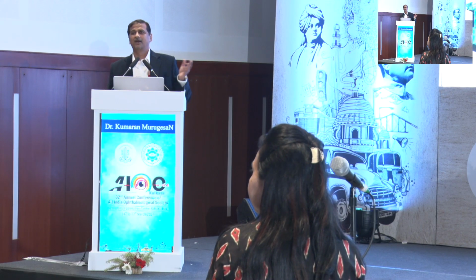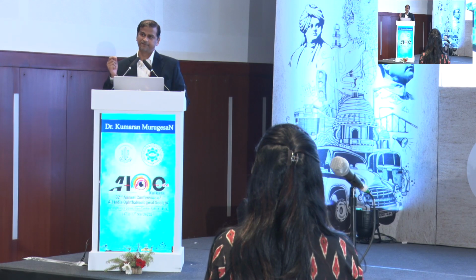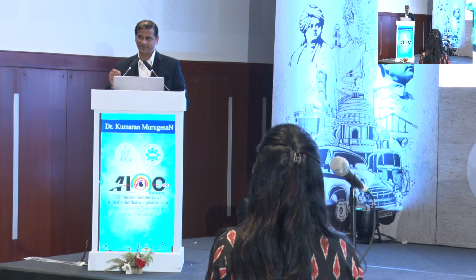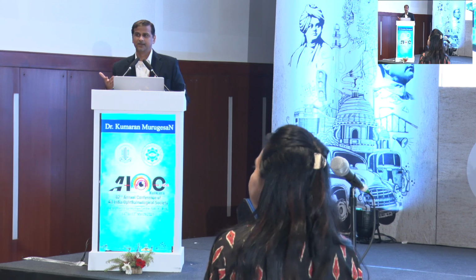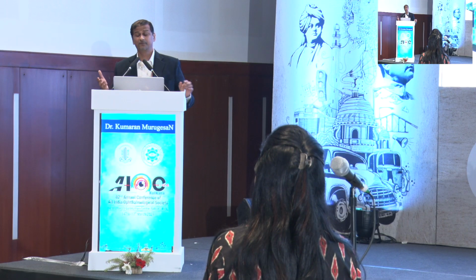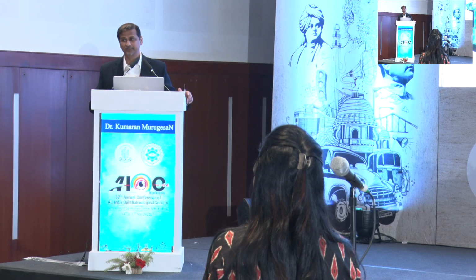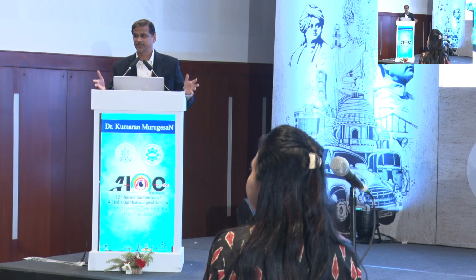Now, what we showed is that once the nursing staff opens up the bin, the first thing they should do is see whether the indicator has changed color. That is what I was trying to say. All the indicators. But with a class 5 with the biological indicator, we cannot do that. So that video is just to tell you that everything has been changed.